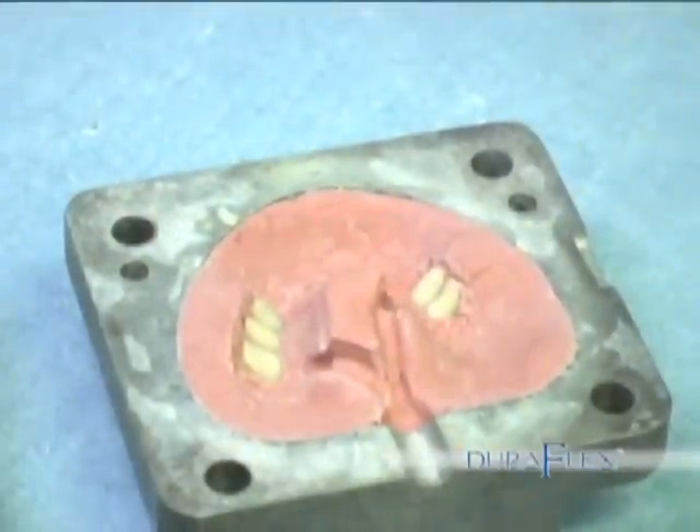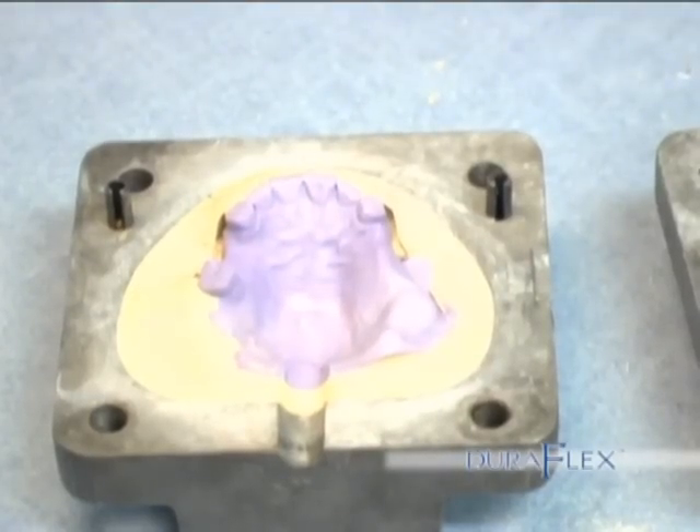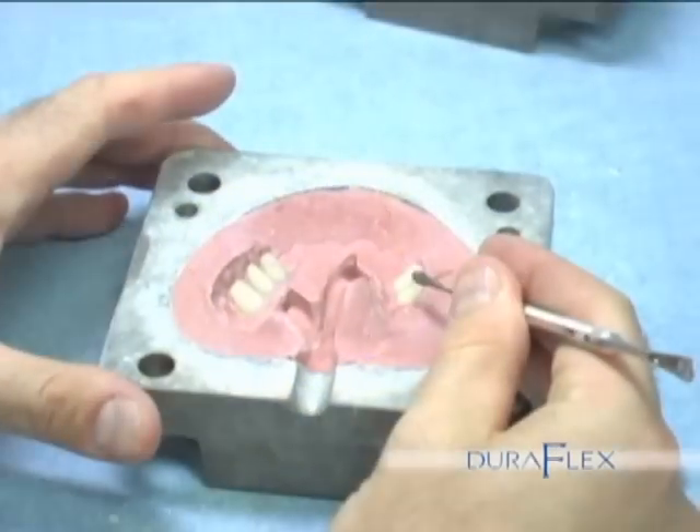Boiling out. Once the stone is set, place the flask in boiling water for about 10 minutes. Separate the flask and eliminate all wax and trim any flash that could break off and mix into the appliance.